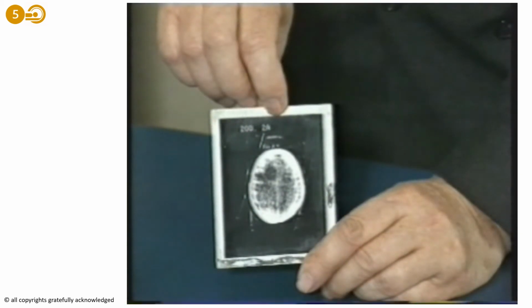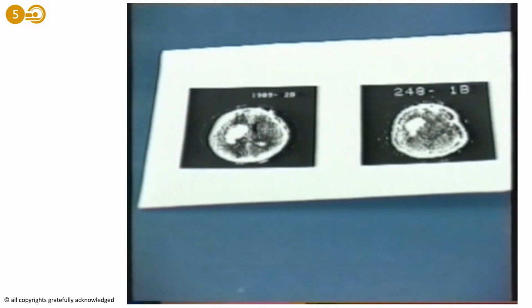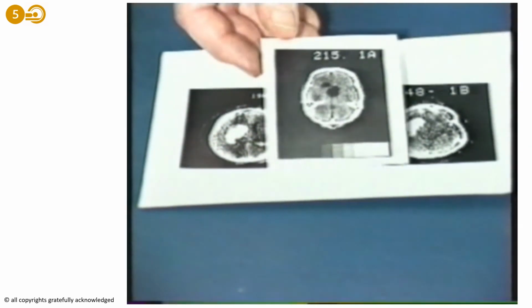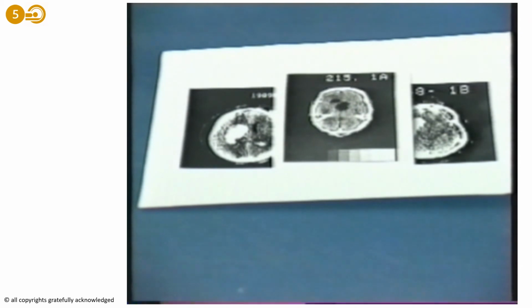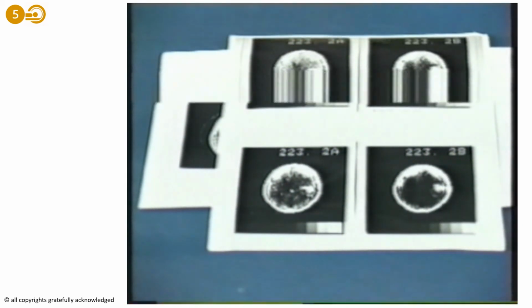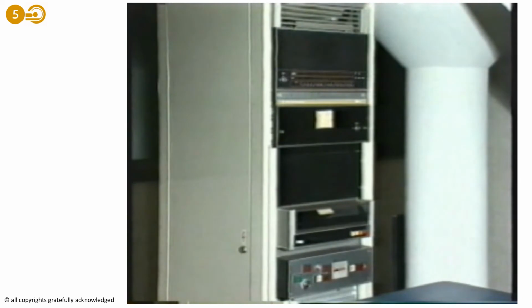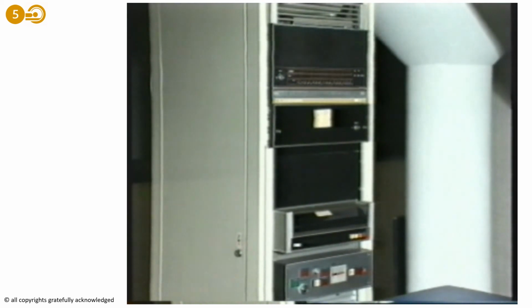This is a well-known picture of the first patient to be diagnosed with this machine. It shows a cyst in the frontal lobe. The machine was an immediate success, and here are some of the pictures that followed, taken by Dr. Ambrose. Originally the pictures were to be sent over telephone lines to a central processor, but the arrival of the minicomputer, giving the ability to process pictures on site, saved the day.